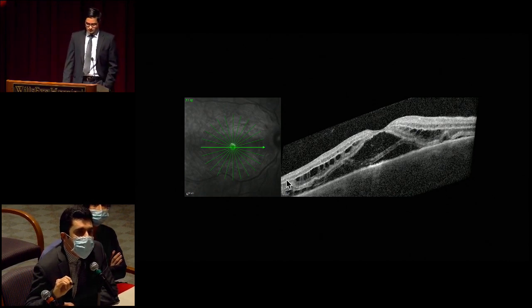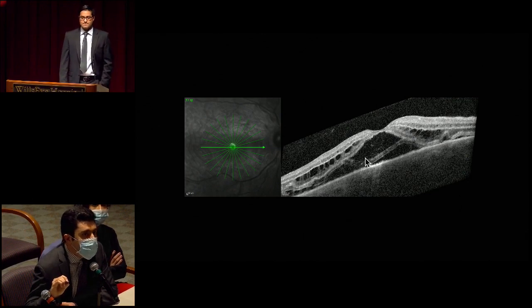So trying to figure out the layers itself. If we think this is the RPE, there's some central RPE clumping here, and then the ellipsoid zone and external limiting membrane seem to have this splitting from the other layers of the retina, causing this waviness and the folds to the outer retina itself. Maybe some fibrinoid reaction here as well in the subretinal fluid too.